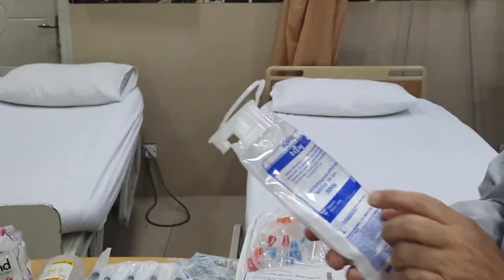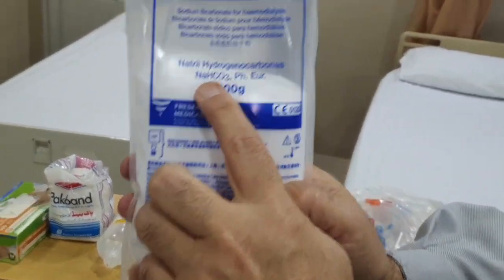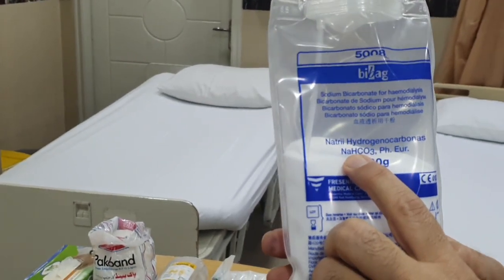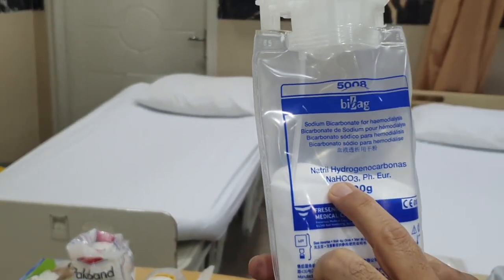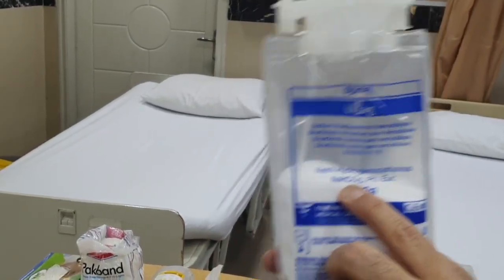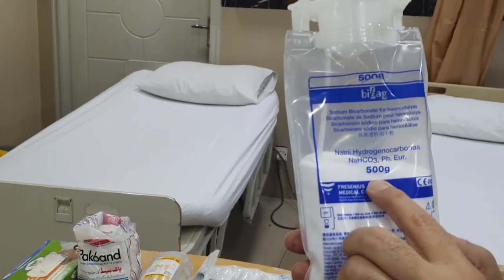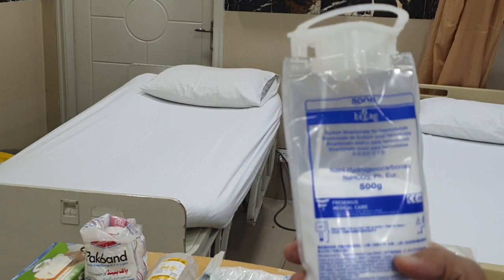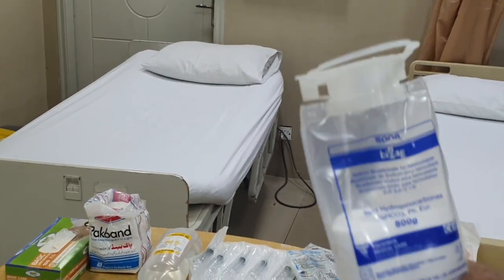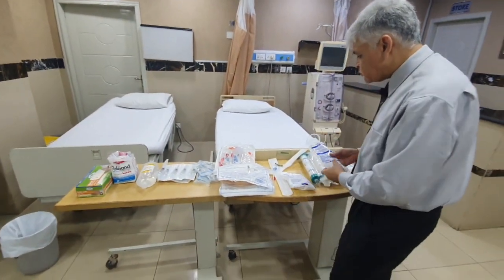And with sodium bicarbonate, you have to remember, when somebody becomes hypertensive during dialysis, you're giving them sodium. So if they become breathless, if they become hypertensive, if they've got volume related problems, and you can't figure out what's happening with them, remember we are giving them sodium bicarbonate directly inside the blood. Therefore you'll have to go into the settings of the machine to reduce the amount of bicarb you want to give, and that will hopefully help the hypertension or the fluid problems in these machines.